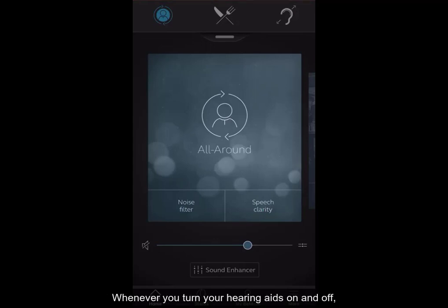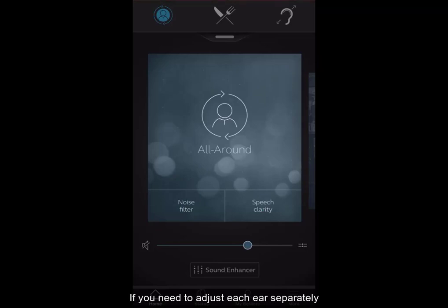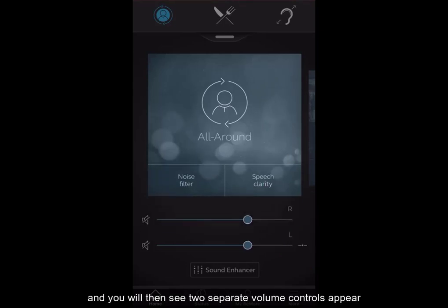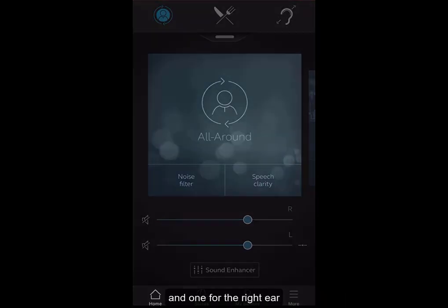Whenever you turn your hearing aids on and off, they will automatically reset to the volume your audiologist has programmed them to. If you need to adjust each ear separately, you need to click on the two lines next to the volume button and you will then see two separate volume controls appear — one for the left ear and one for the right ear.